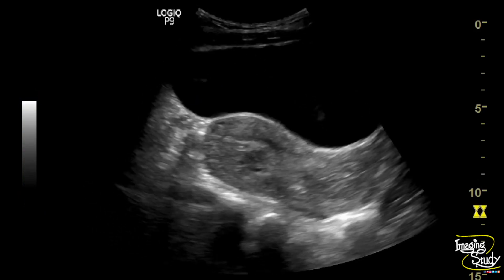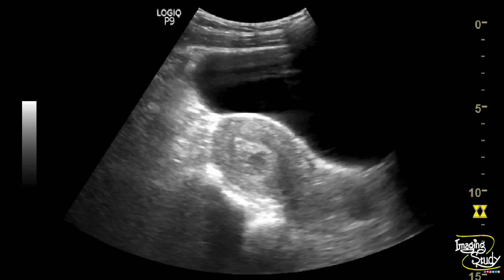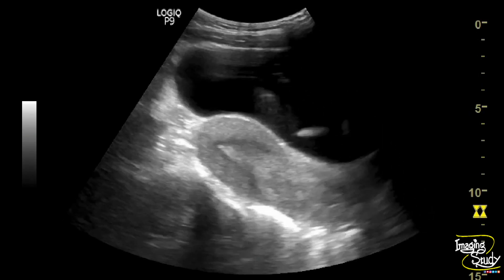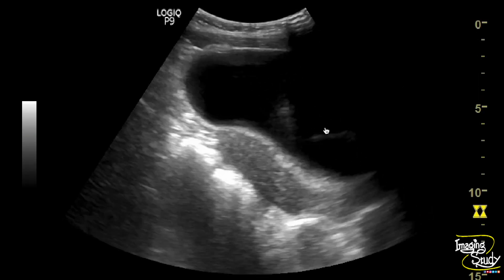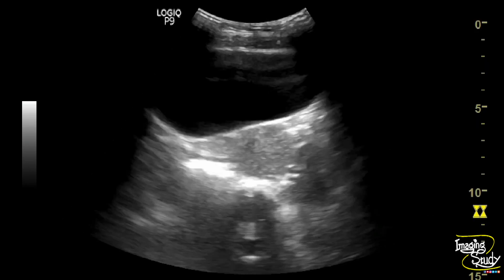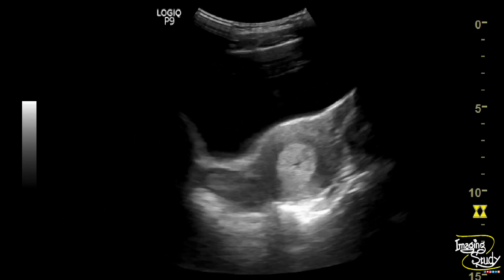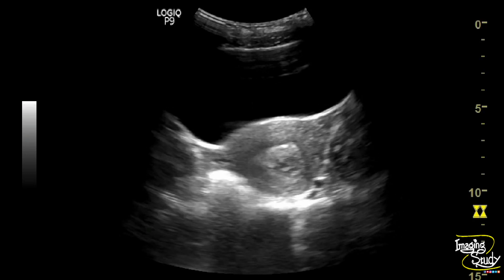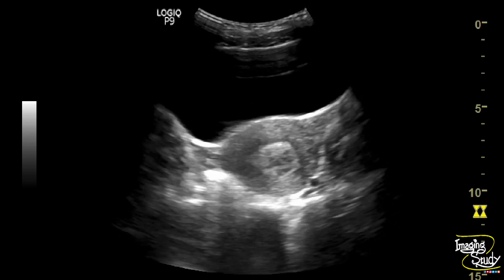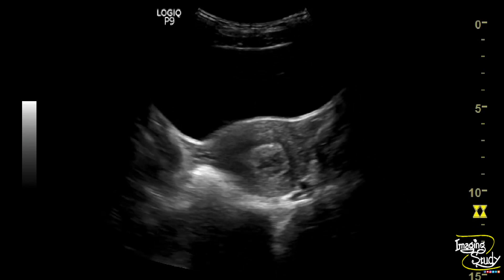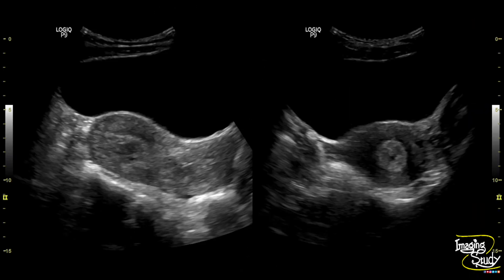This feature suggests a case of retained products of conception or incomplete abortion. Here you can see the irregular mixed echogenic substances within the uterine cavity, both in longitudinal and transverse sections.